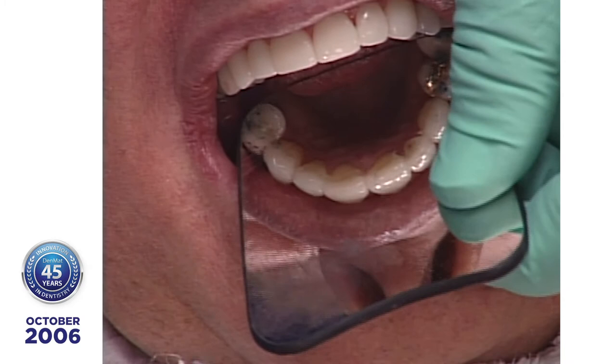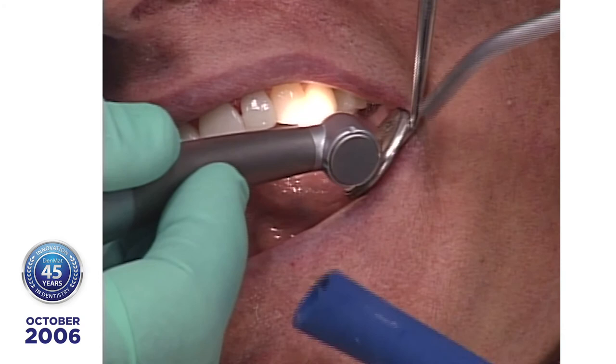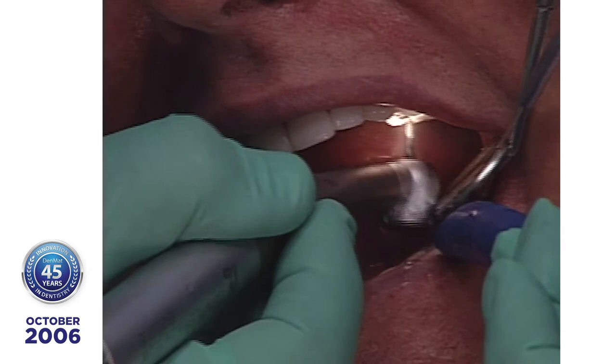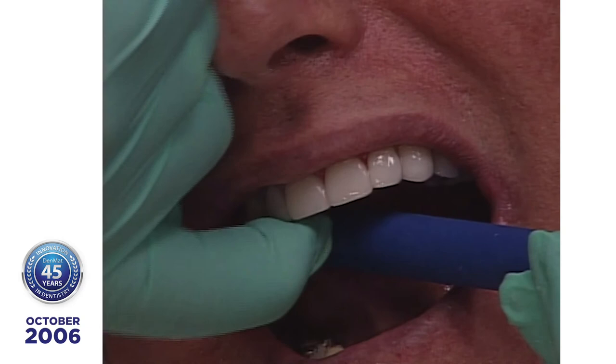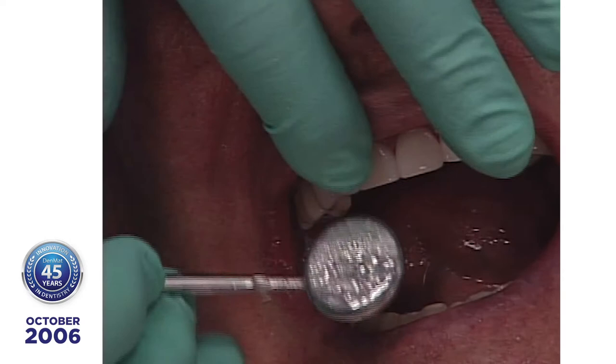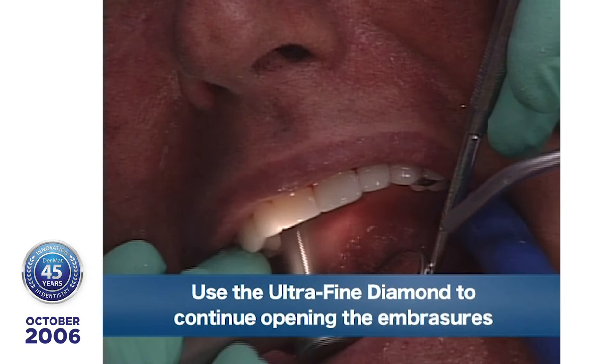Usually what I do with patients is I limit this visit to about an hour to an hour and a half, and I don't get everything finished. I open the easy contact points, and you want to be sure where you bonded porcelain to porcelain that you don't have any trauma. Because I tell patients they can eat, but don't overstress that tooth until the next day or the next week. Now let's take a look here. I'm going to use a long, narrow diamond and open these embrasures a little bit more.